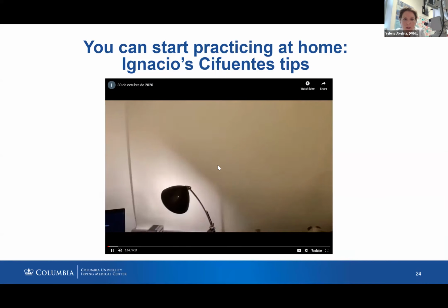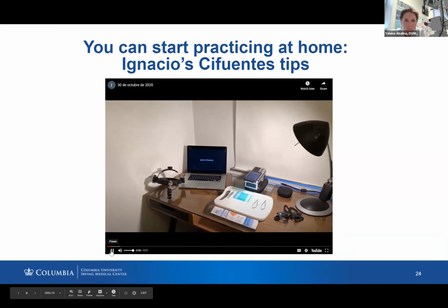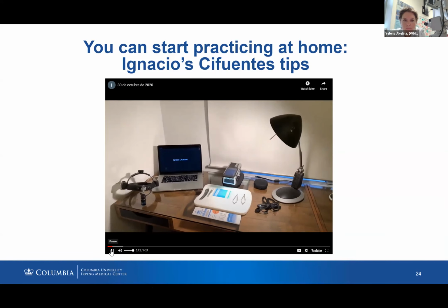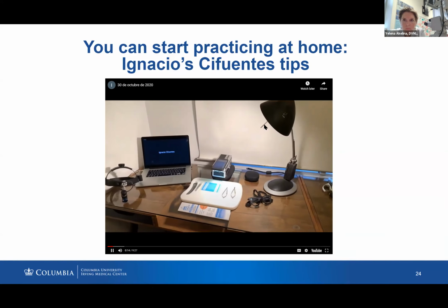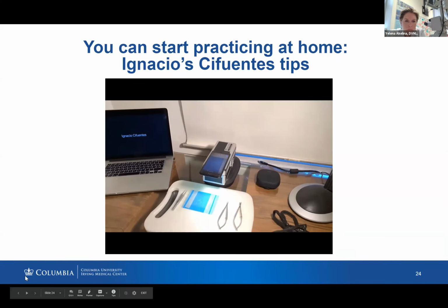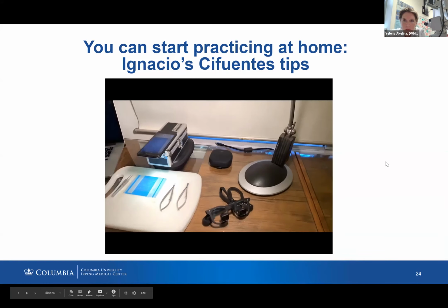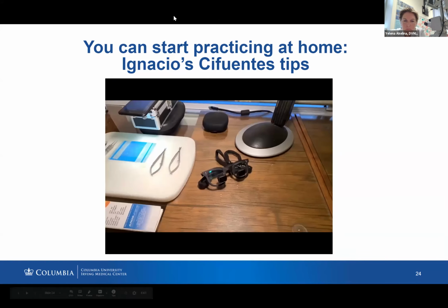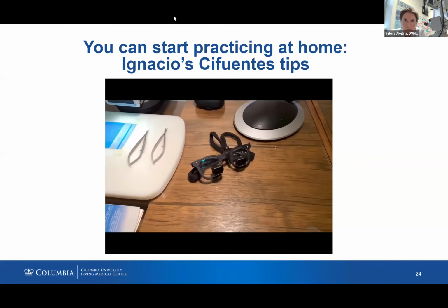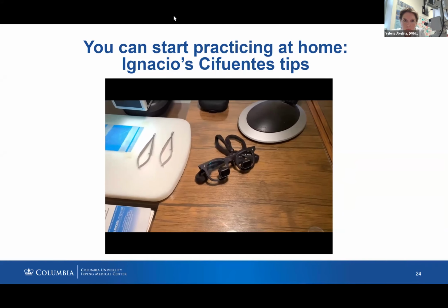It's a really great job, and I would like to share with you my home-based micro training setup. I think it should be very simple. I use a smartphone for recording my training sessions. And for augmentation, I use 2.5 loops. Ideally, it would have to be 3.5, but this is what I've got now.